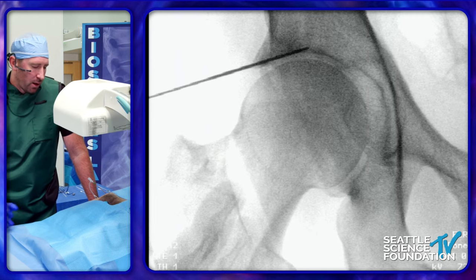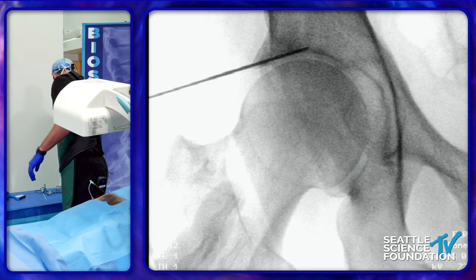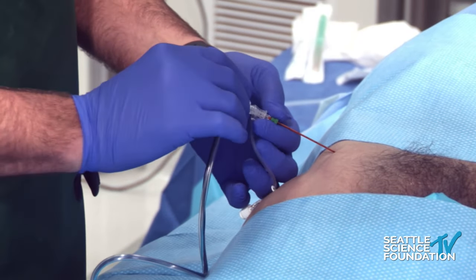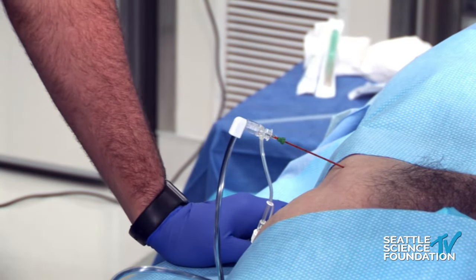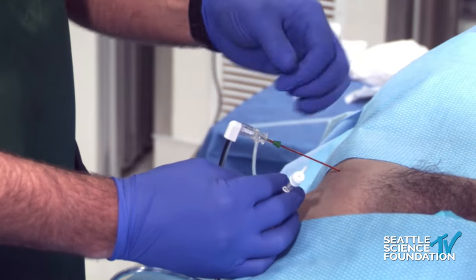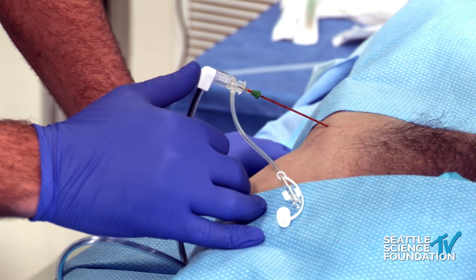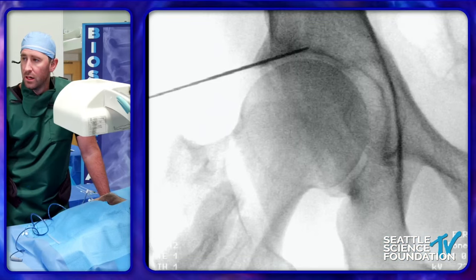Once you're in position, you take the stylet out and put the probe in. We have two access ports that hook up to the generator. It keeps the tip at a cooler temperature while the surrounding surface area gets to 80 to 85 degrees Celsius. The unique feature is the side port — once you get the probe in and do your motor testing, you can inject lidocaine or your local anesthetic of choice to numb it up and give some relief before we run the energy cycle. Typically for the femoral burn, we go at the 12 o'clock and redirect to about the 11 o'clock position.